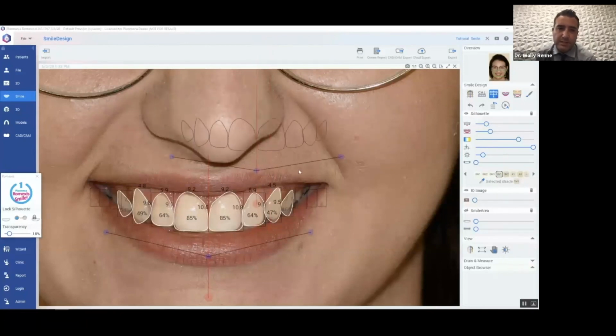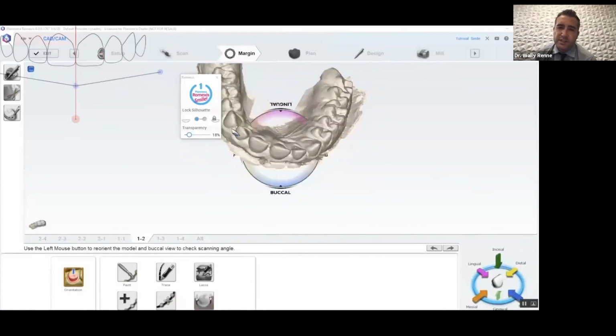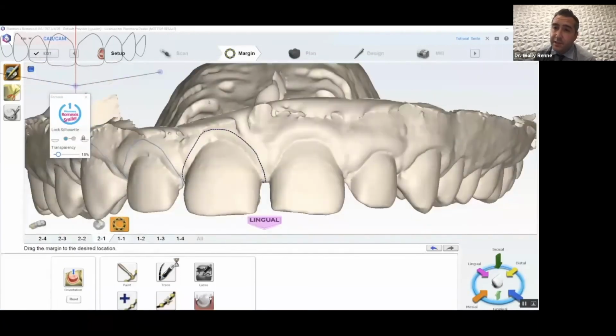But here's this little silhouette. And we have this silhouette. By the way, you guys notice the midline deviation. A midline deviation of 2 millimeters is considered unnoticeable by most people. So not an issue. If there's a cant to the midline, then we have real issues.